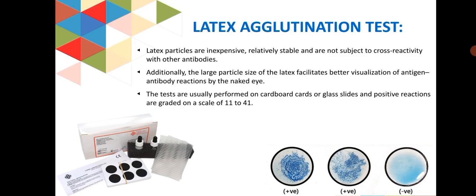The tests are usually performed on cardboard cards or glass slides, and positive reactions are graded on the scale of 1+ to 4+.